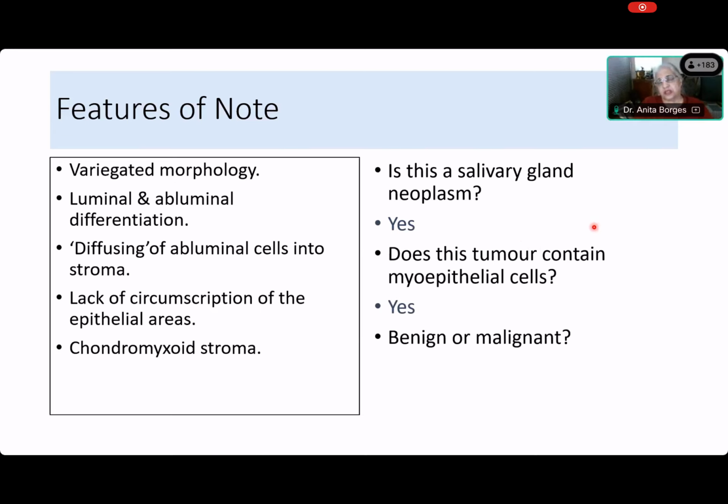What has to be invaded? Where do you look for invasion? In the stroma. Oh my, okay. So then there is enough invasion into the stroma, no? Ma'am, there is a perineural and perivascular invasion. We saw perineural and perivascular invasion.